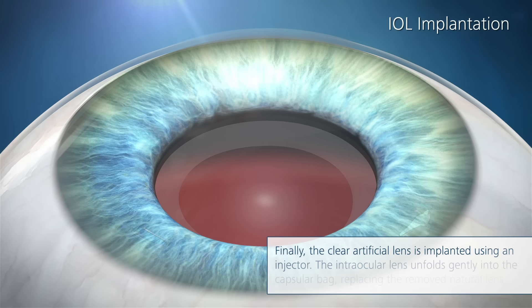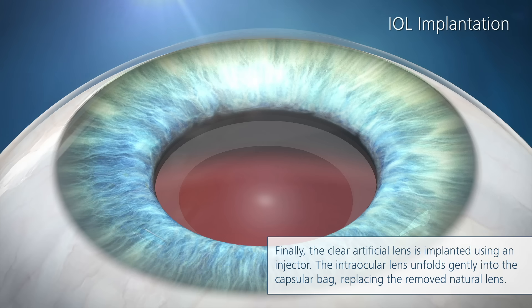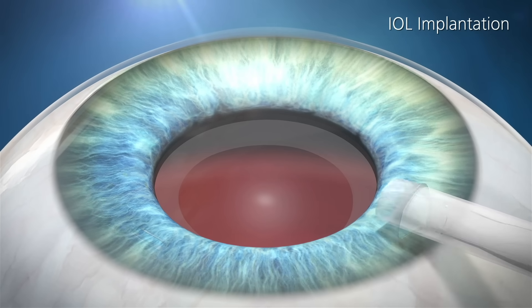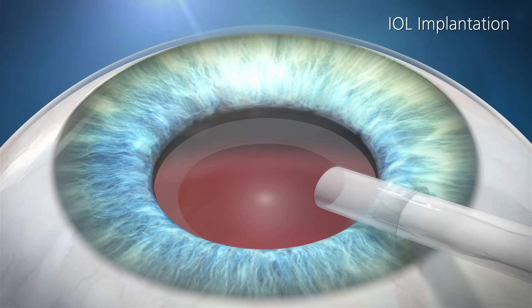Finally, the clear artificial lens is implanted using an injector. The intraocular lens unfolds gently into the capsular bag, replacing the removed natural lens.